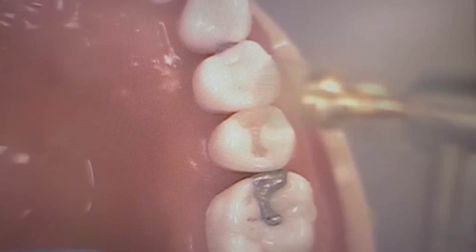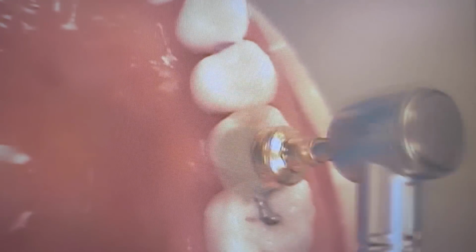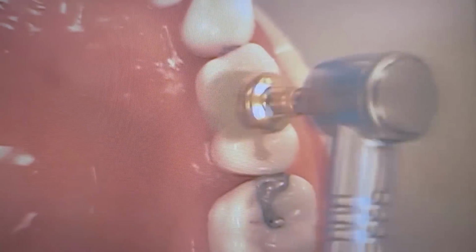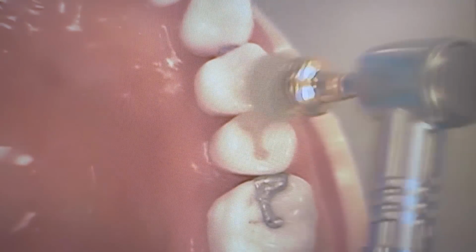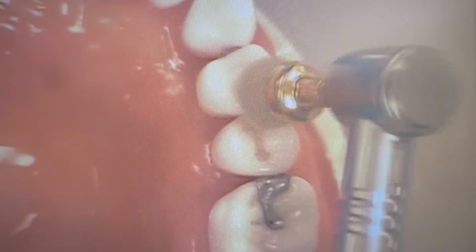I can do more. The tooth is dry now. I'm afraid of doing too much. Using the OptiBrush, you're going to use this in a tapping motion. Tap, tap, tap, tap. Not applying too much force.